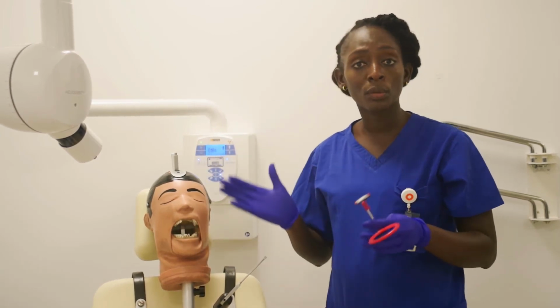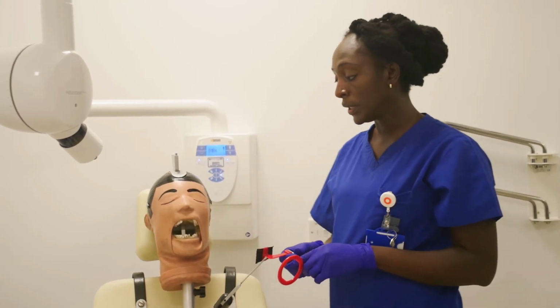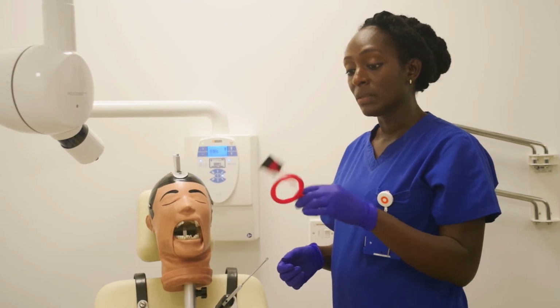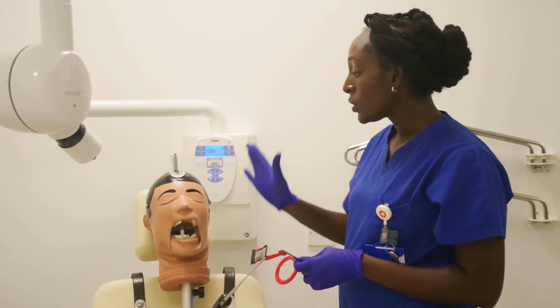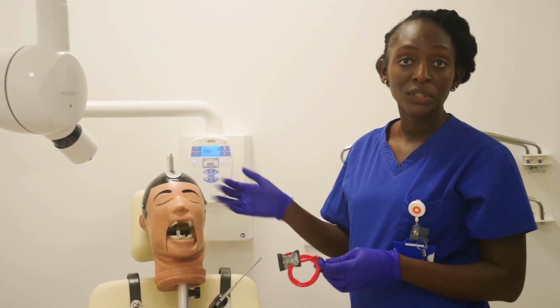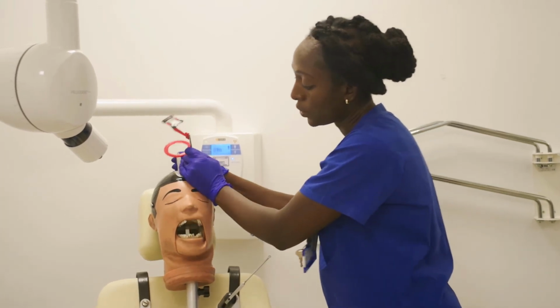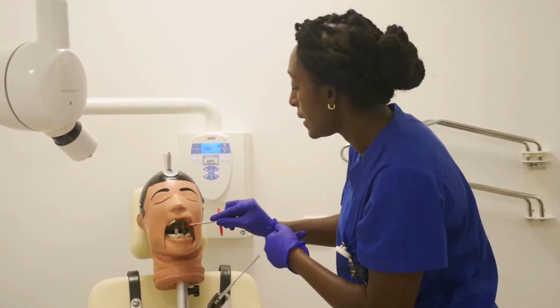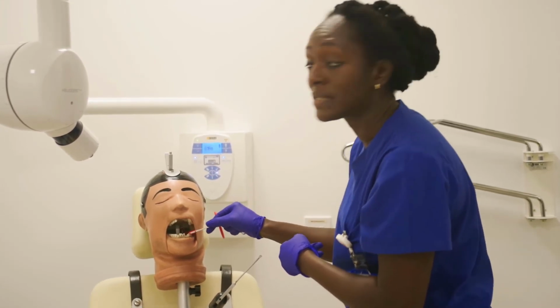So you go through all your preparation as well: name, date of birth, if they've got anything removable in the mouth. As Mark said, for the bite wing, it doesn't really matter. The same setup can be used for both the left and right. Since I'm standing on the left, I'm going to take the left bite wing. So I ask Dexter to open really wide, and then I place this in the sulcus parallel to the long axis of the teeth.